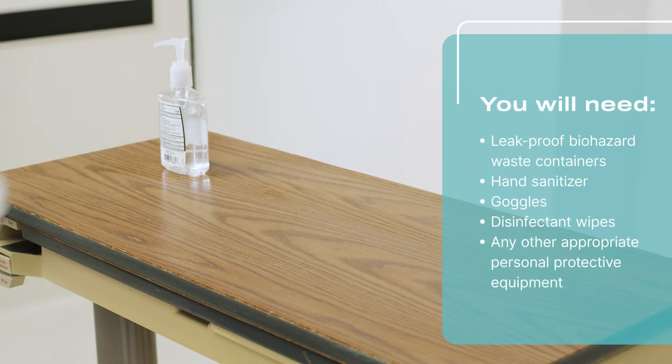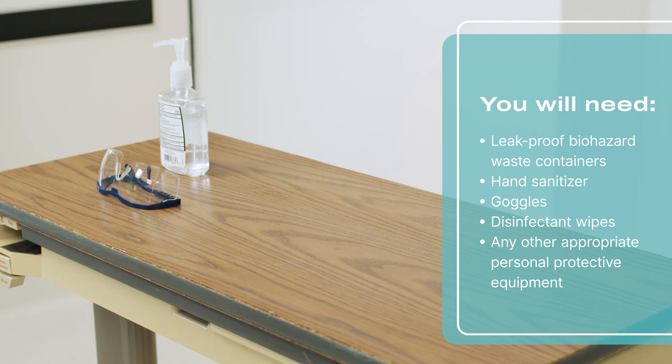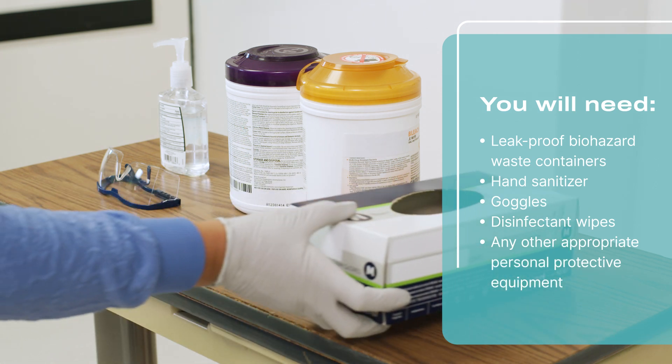Once the station is prepared, gather the following supplies: leak-proof biohazard waste containers, hand sanitizer, goggles, disinfectant wipes, and any other appropriate PPE.